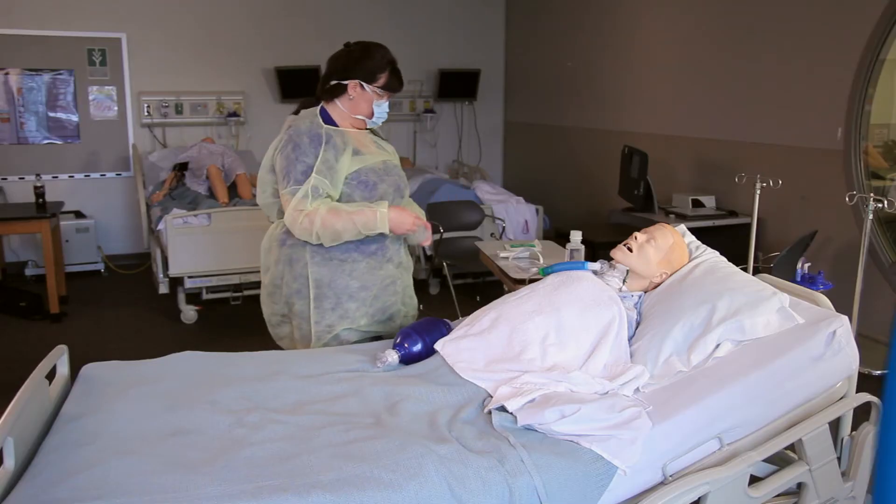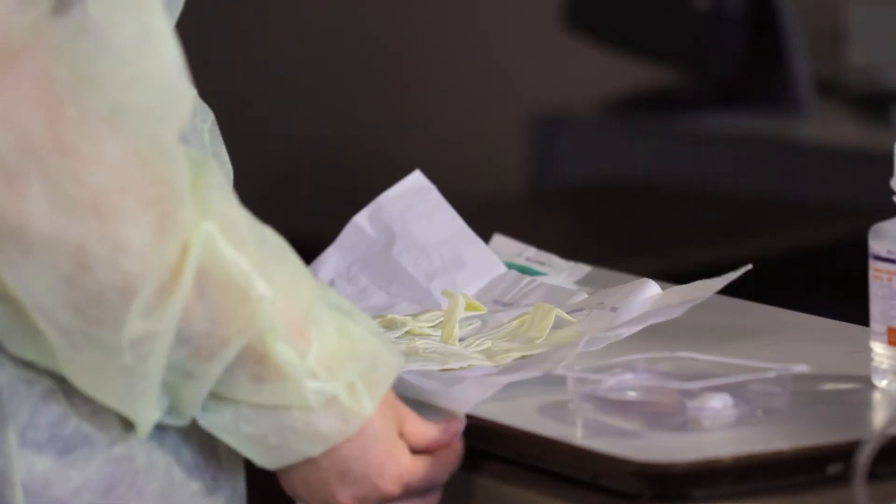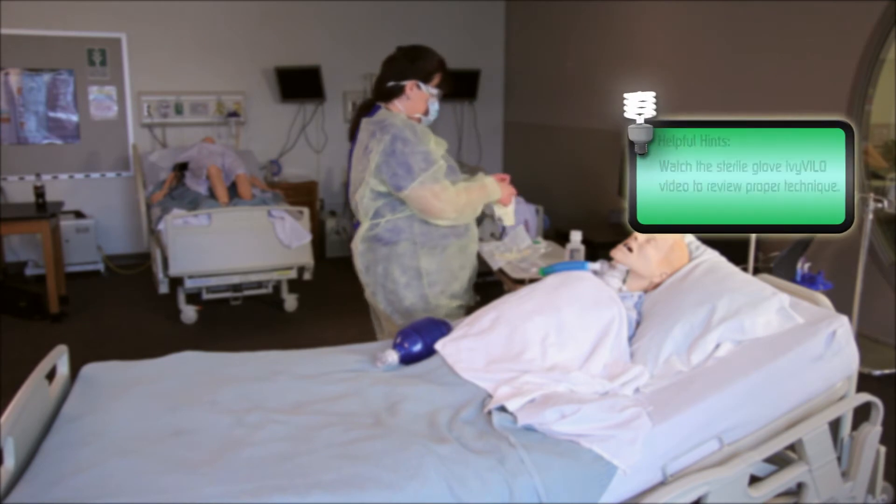Remove gloves. Perform hand hygiene. Put on sterile gloves. Review the sterile gloving video if needed.